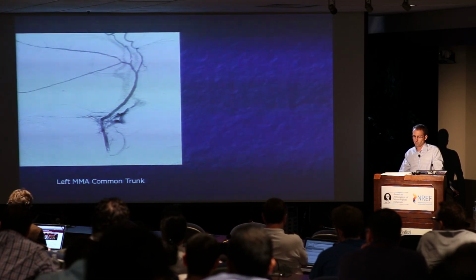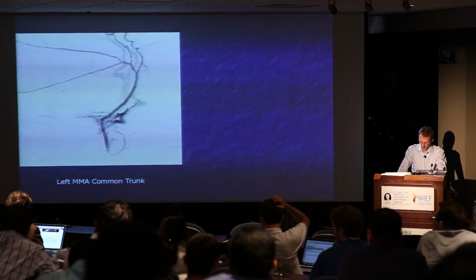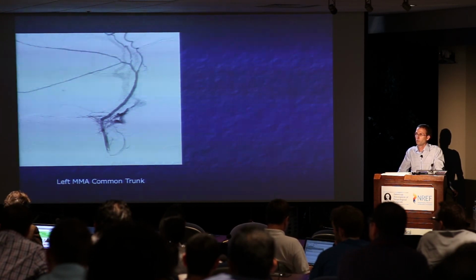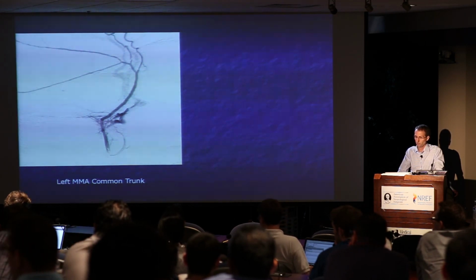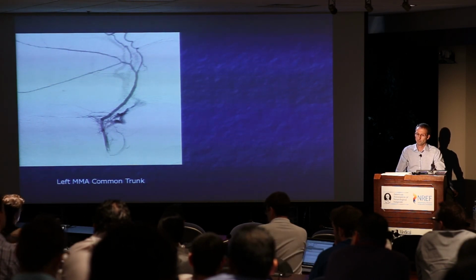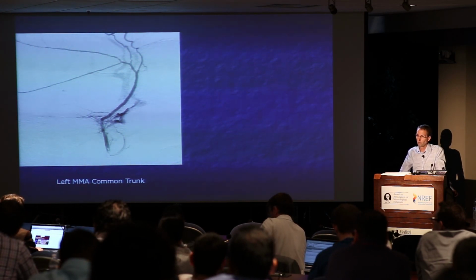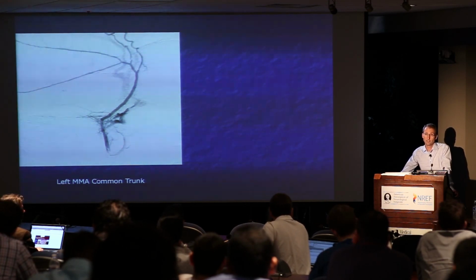Yeah. And I will beat myself up for missing exactly where the fistula is, where the extent is, and I am often frustrated when I'm left to clean up for somebody else doing the same thing. So as much as I have ADD, which I will admit, and want to move forward with treating whatever, this is where you've got to slow down and be patient and analyze, as Joey is telling you. That's the mistake you will make. I'm telling you. You will neglect to fully analyze, look at every view, look at every injection, and you will hate yourself for it. Yeah, so I totally agree with that.